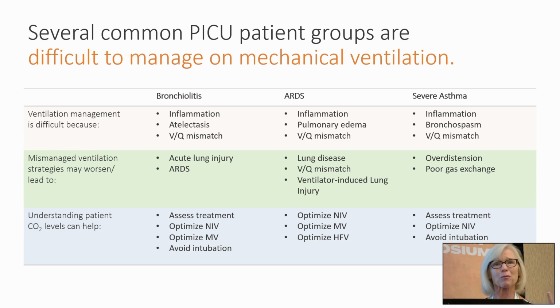But what's the other big thing we do as respiratory therapists? Ventilation. And how do you assess ventilation? A couple of ways. You look at their work of breathing, also you look at their CO2. But we don't really look that closely at the CO2 because it's a harder value to get. And we'll talk about that some more.